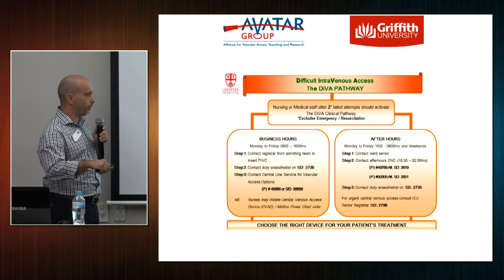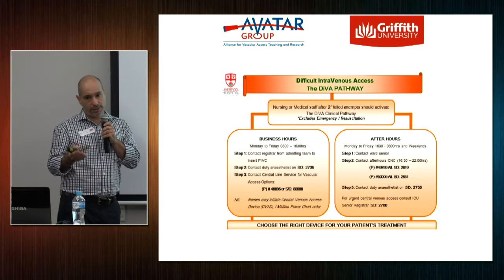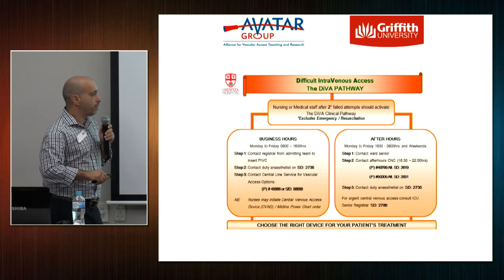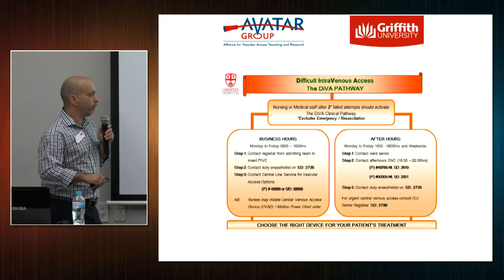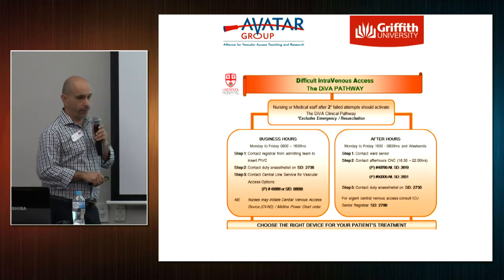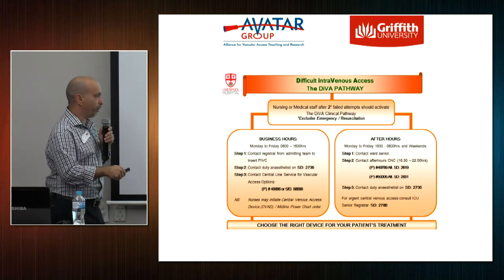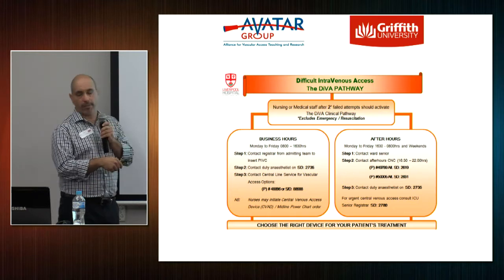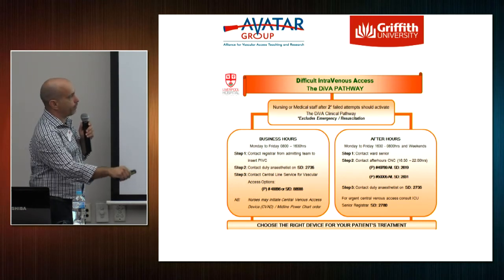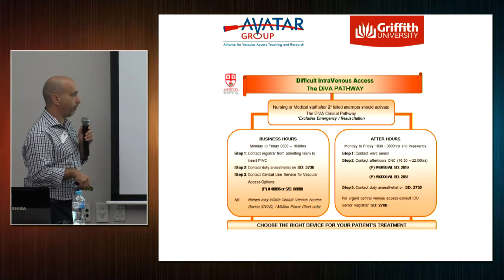Probably the biggest thing we did also was that the PIVC under ultrasound, if someone's got difficult access, is really just a bridge until you can get more secure access. The biggest thing we did was that we put it in policy that nurses, once they've discussed the situation with the medical staff, could initiate an order. So they could go onto PowerChart and initiate the order of a central line or a midline, or we just say put in CVAD, and then when we assess the patient, we can make the decision as to what's the best device. And it also gives the staff a bit of an indication as to what the different types of devices are for and how long they can last for.